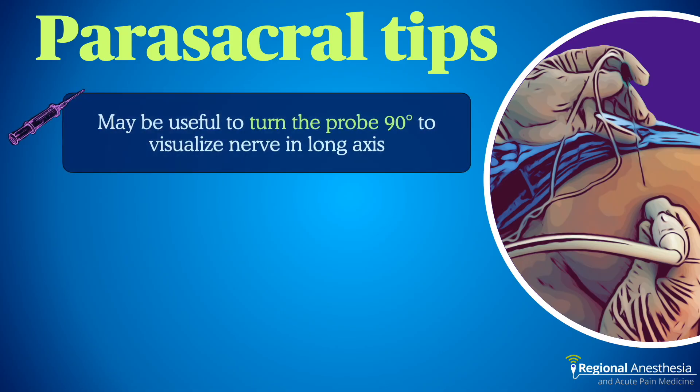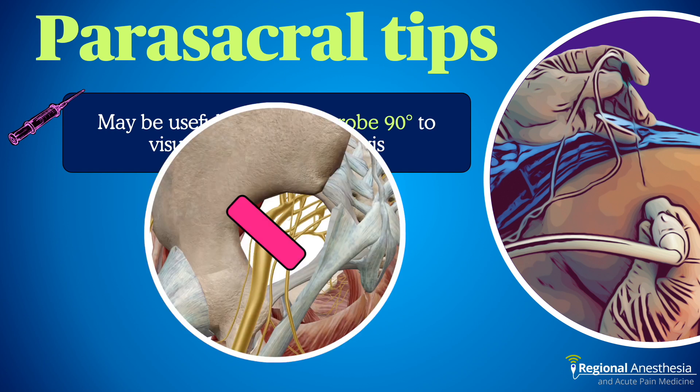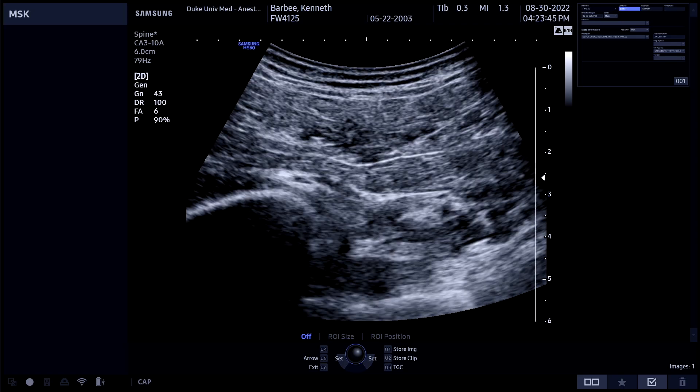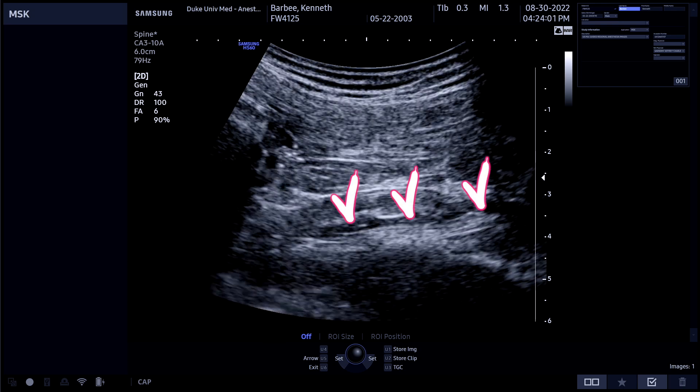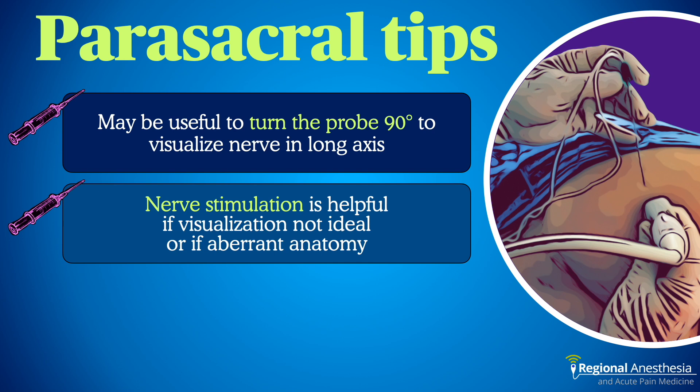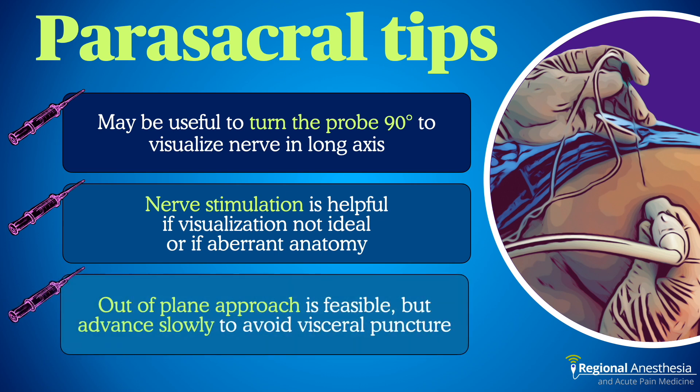Here are some parasacral tips. First, we've placed the probe angled from superior-lateral to inferior-medial with purpose, so we can image the nerve in short axis. There are descriptions of imaging the nerve in long axis as well — by turning the probe, you can see the nerve emerge from the sciatic notch and run up over the ischium. This may be useful if the nerve is difficult to see in short axis or to confirm the spread of local anesthetic longitudinally along the nerve. Second, nerve stimulation is very useful to confirm nerve location, especially when it's not visualized all that well. Moreover, in about 10% of people the sciatic nerve runs through or over the piriformis muscle, so the nerve may not be where you expect it — nerve stim can help prevent a failed block in these cases. Lastly, some advocate for an out-of-plane approach. This is feasible, but since needle visualization is poor, care must be taken to avoid driving it through the notch and into the pelvis. Liberal hydro-location is advisable as the needle is slowly advanced with any out-of-plane technique.